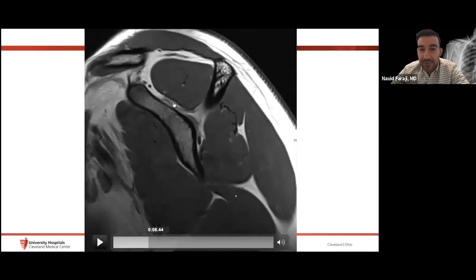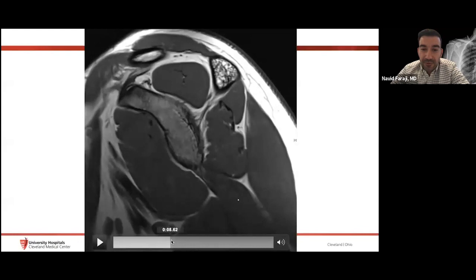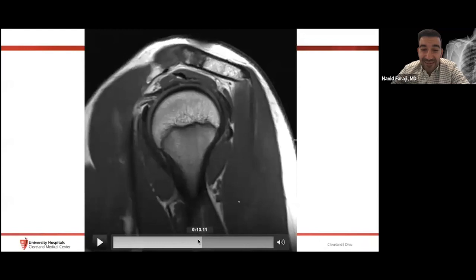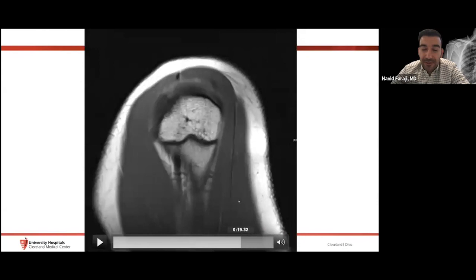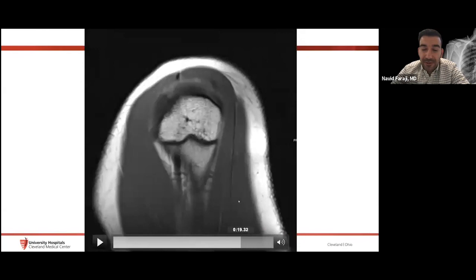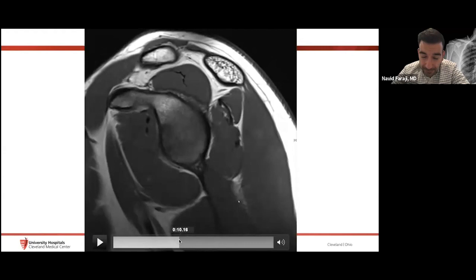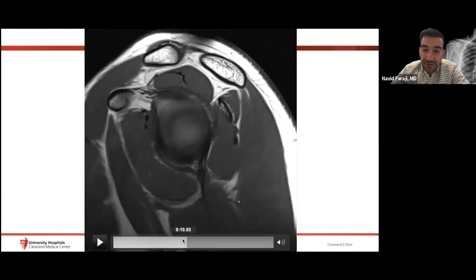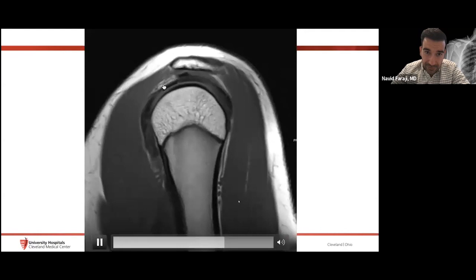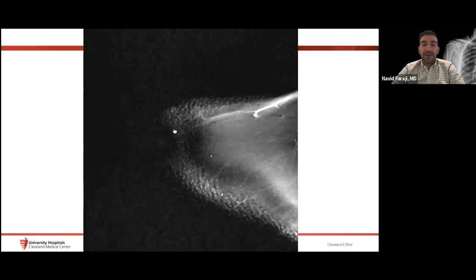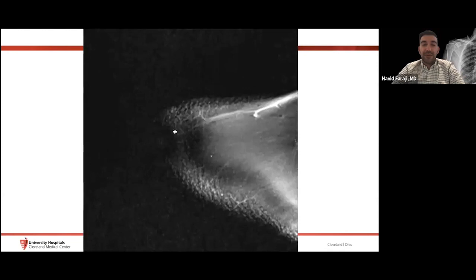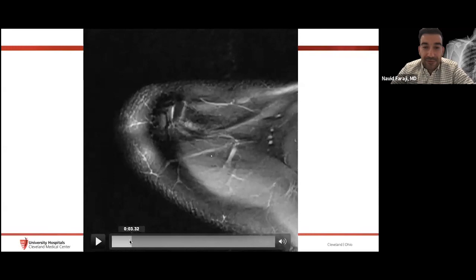On the sagittal view we can also identify the suprascapular nerve coursing through the spinoglenoid notch — impingement syndromes can occur here. The axillary neurovascular bundle is visible in the quadrilateral space. The AC joint and the underlying fat plane are important — I look for maintenance of that fat plane beneath the acromioclavicular joint when assessing for external impingement. The sagittal plane is also excellent for following the long head biceps tendon from the supraglenoid tubercle out through the intertubercular groove.